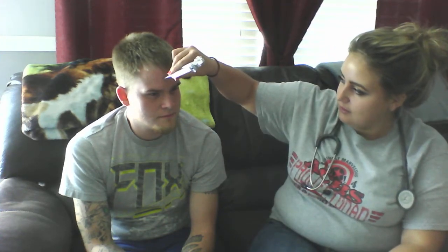So what we want to do is put this tuning fork on the middle of his head, and he should have equal hearing on both sides of that, okay? Hearing on both sides? Okay. And then we're going to do the Rinne test to test his hearing. This is where we put the end of the tuning fork on the mastoid bone, and if he hears it greater there, then he has some hearing loss because his bone conduction would be greater than his air conduction. So we're going to see where he hears this best at.